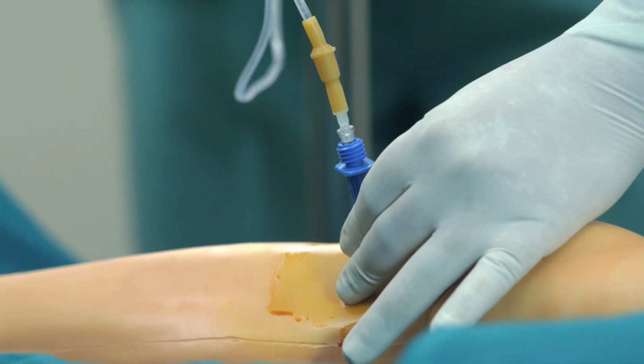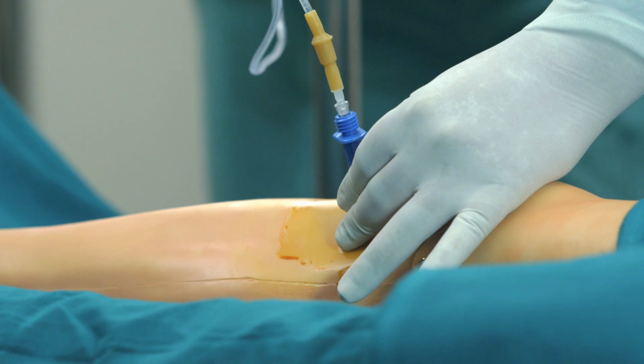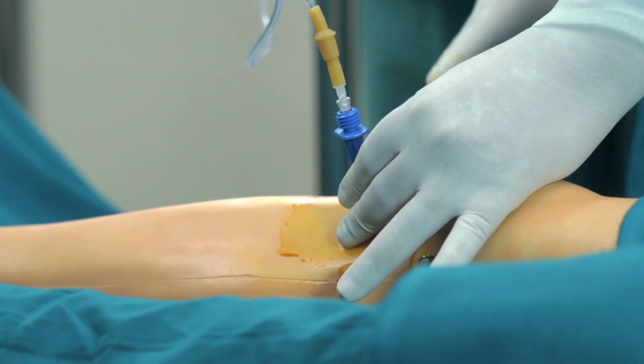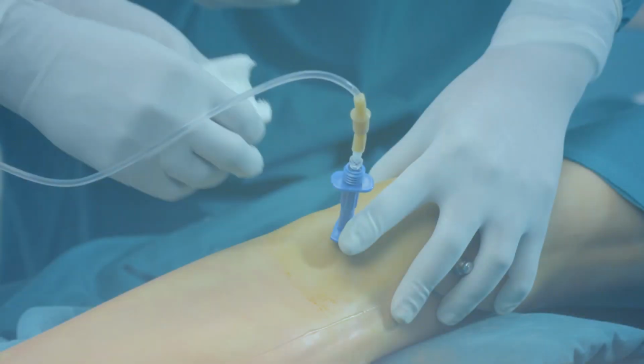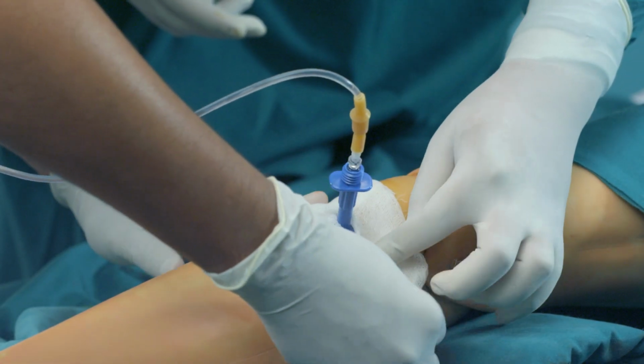If the fluid does not flow easily, reposition the needle by pulling back slightly. But if the resistance is encountered, the needle should be removed and a new site has to be selected. Secure the needle with the bulky gauze dressing and micropore tape.